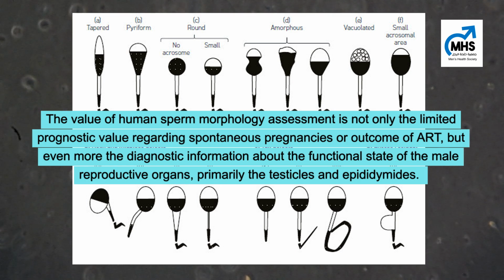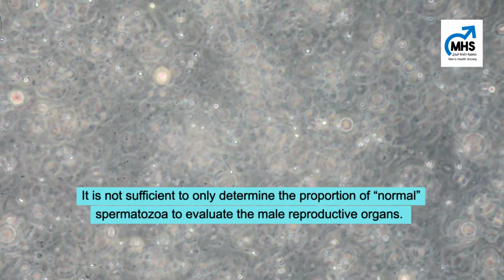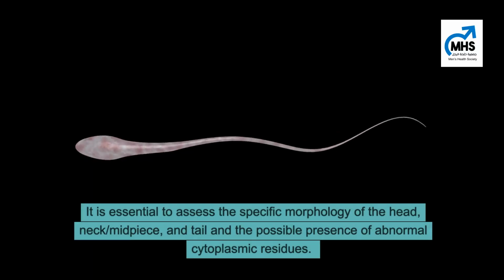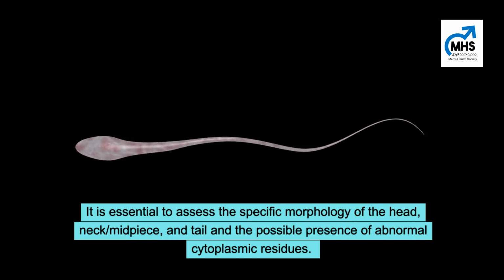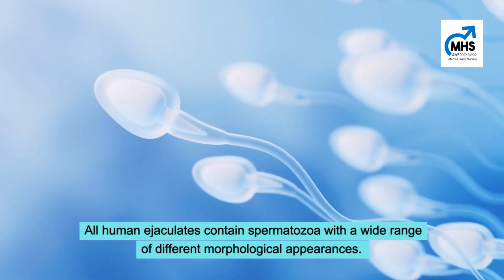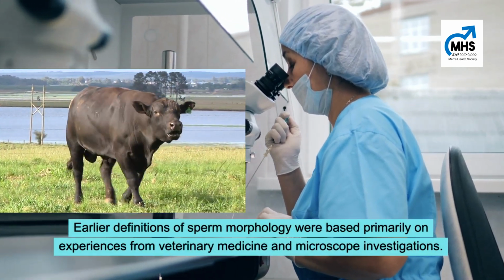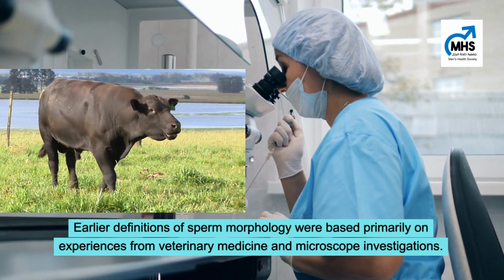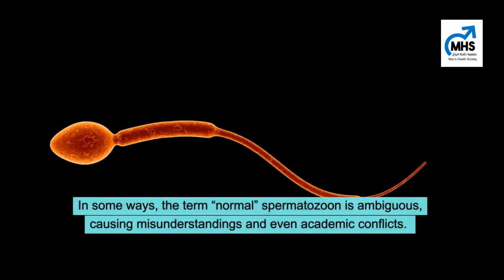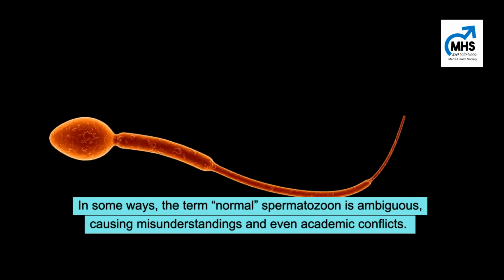testicles and epididymides. It is not sufficient to only determine the proportion of normal spermatozoa to evaluate the male reproductive organs. It is essential to assess the specific morphology of the head, neck, midpiece, and tail, and the possible presence of abnormal cytoplasmic residues. All human ejaculates contain spermatozoa with a wide range of different morphological appearances. Earlier definitions of sperm morphology were based primarily on experiences from veterinary medicine and microscope investigations. In some ways, the term normal spermatozoon is ambiguous, causing misunderstandings and even academic conflicts.